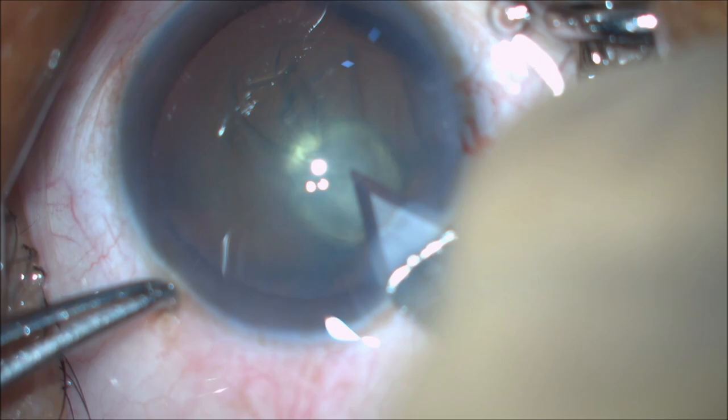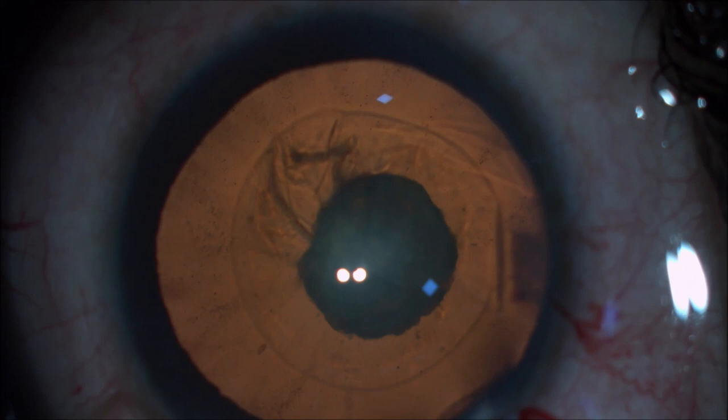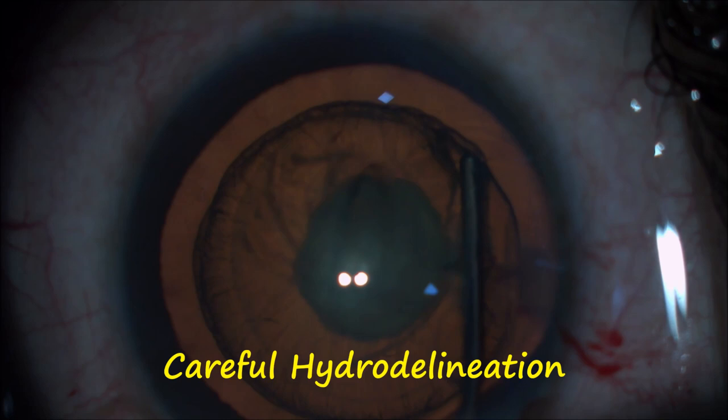Main port entry is made with a 2.8 mm keratome. Care should be taken to maintain the architecture of the entry to reduce postoperative astigmatism and wound leakage.